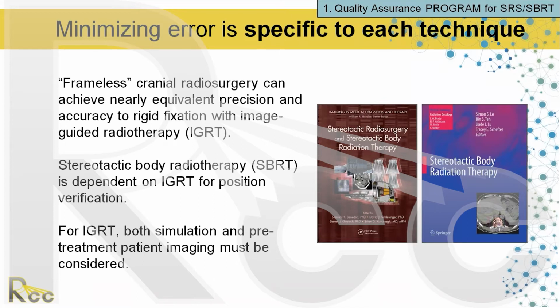I want to be clear that we used to do frames. We used to rigidly fixate individuals. Frameless is just as good, and more people are actually doing it. Just got to know your system and know what you can achieve. So with all these stereotactic treatments, we used to do them with frames and boxes and we'd use film. But I think it's pretty accepted that now IGRT is a requirement for doing this properly, to ensure that you're shifting the patient well and you've got them in the right position. And that's why we'll talk about IGRT next week.